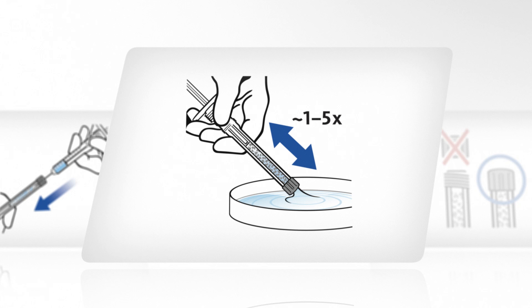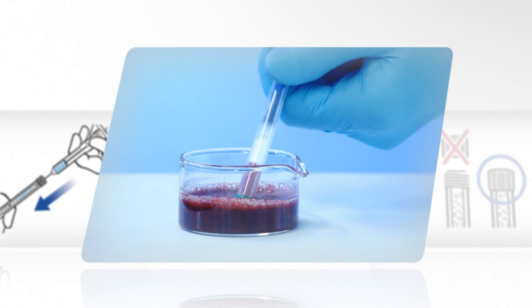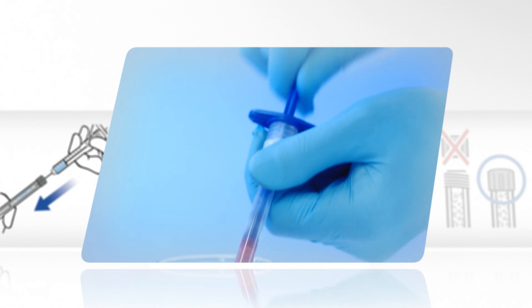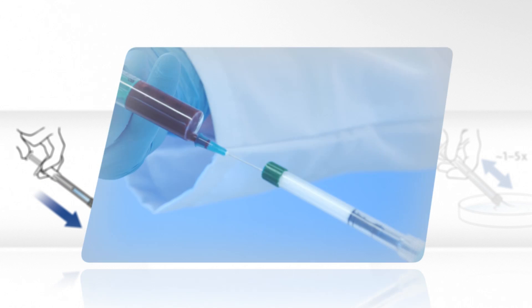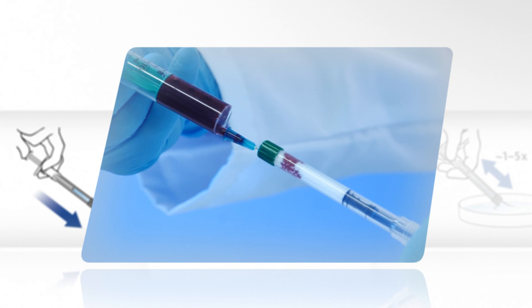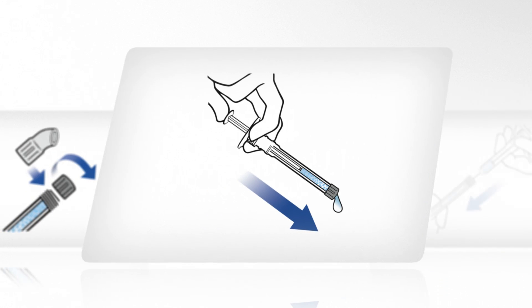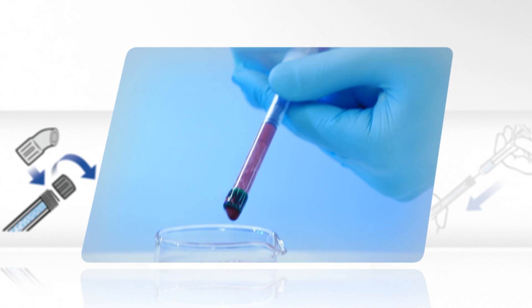Draw up either sterile physiological saline solution or patient blood. Alternatively, use a separate syringe to moisten the Geistlich Bio-Oss. Remove excess fluid by gently pressing the plunger.